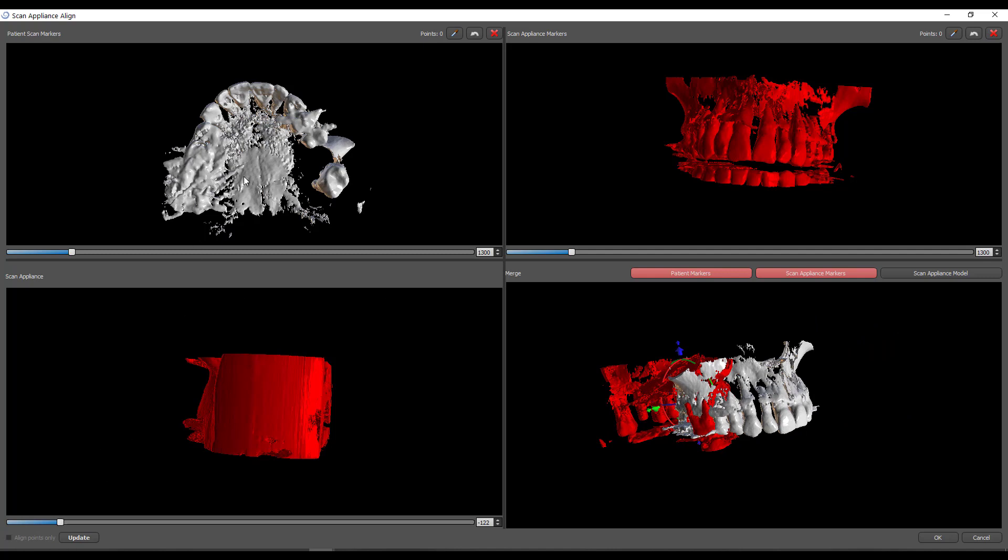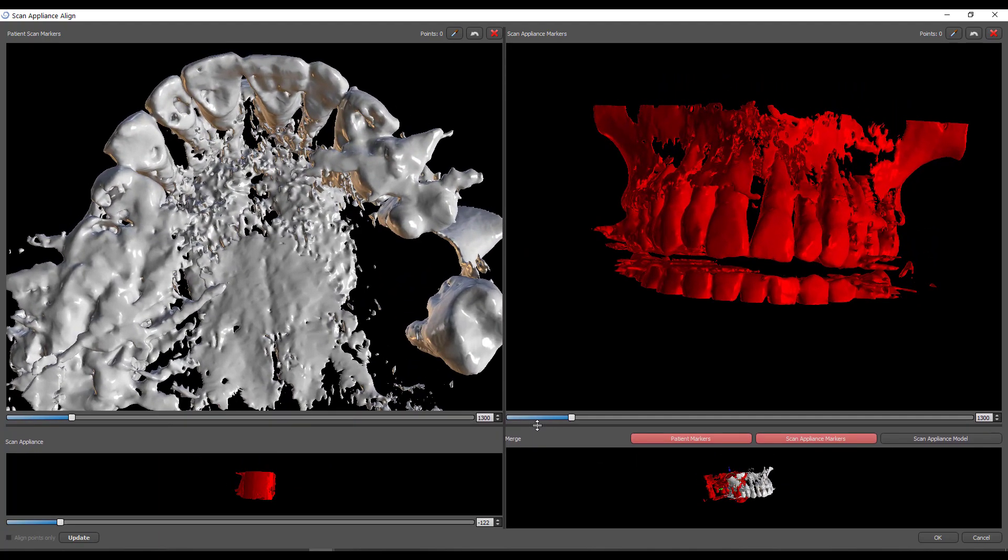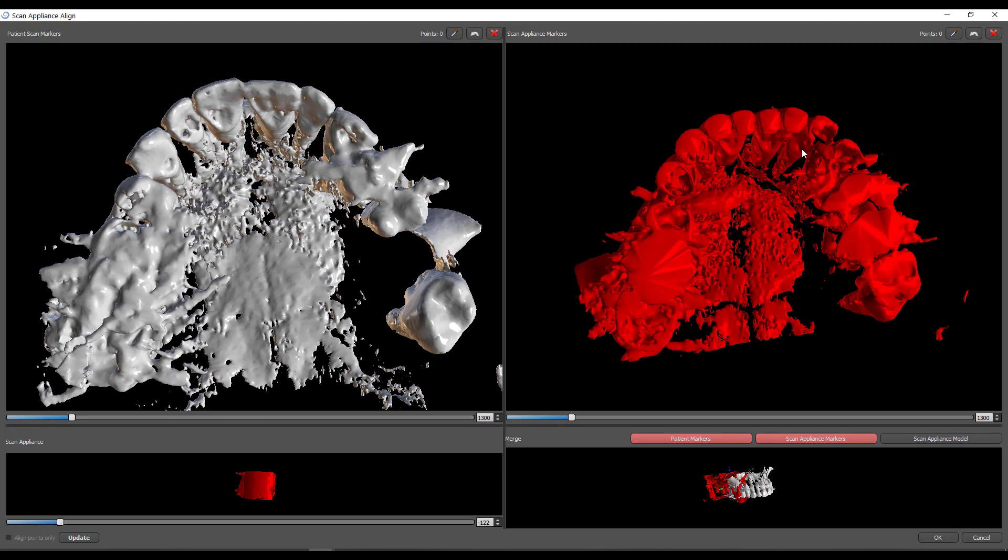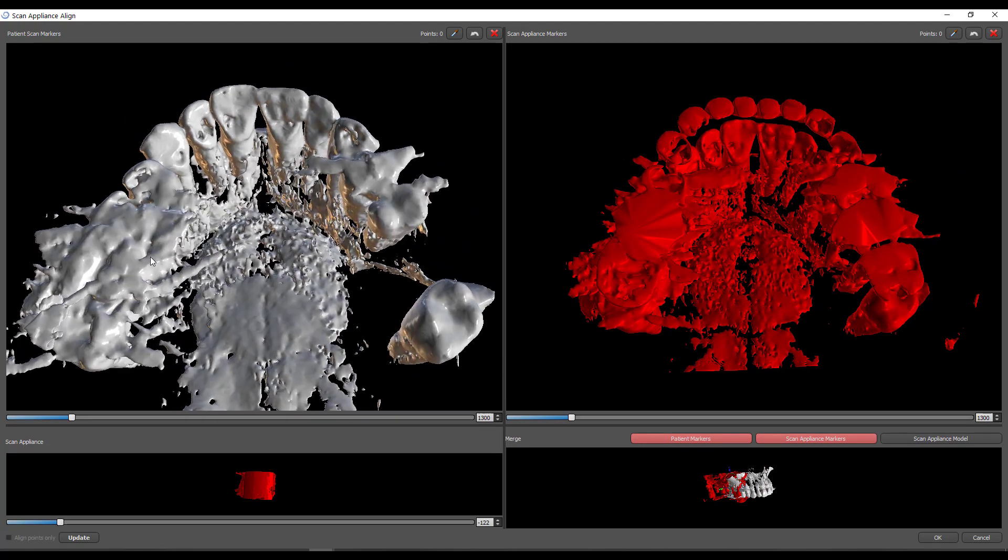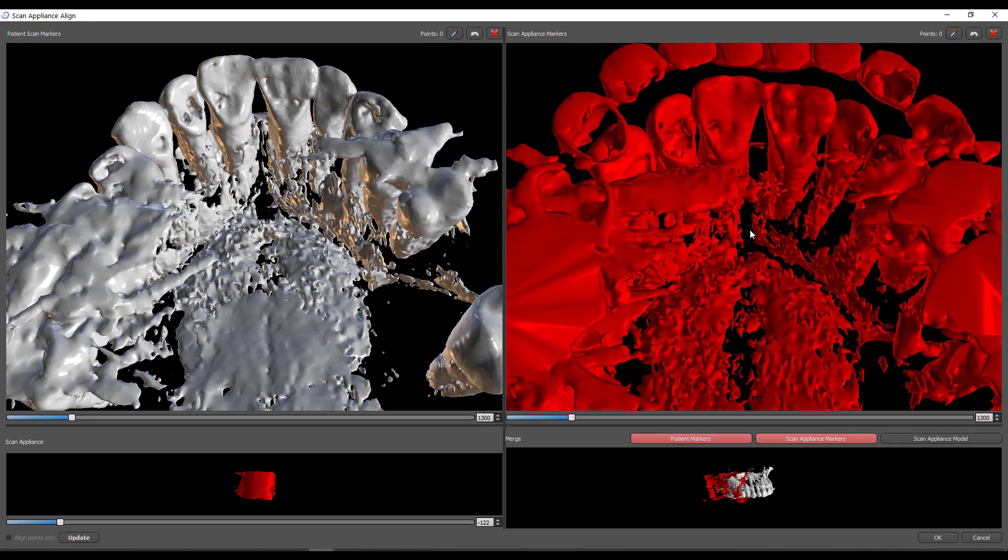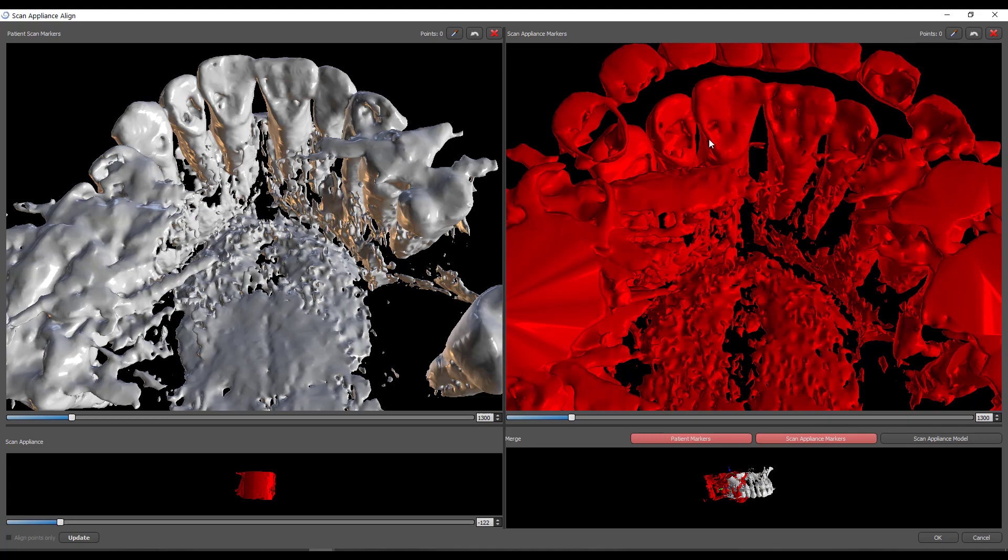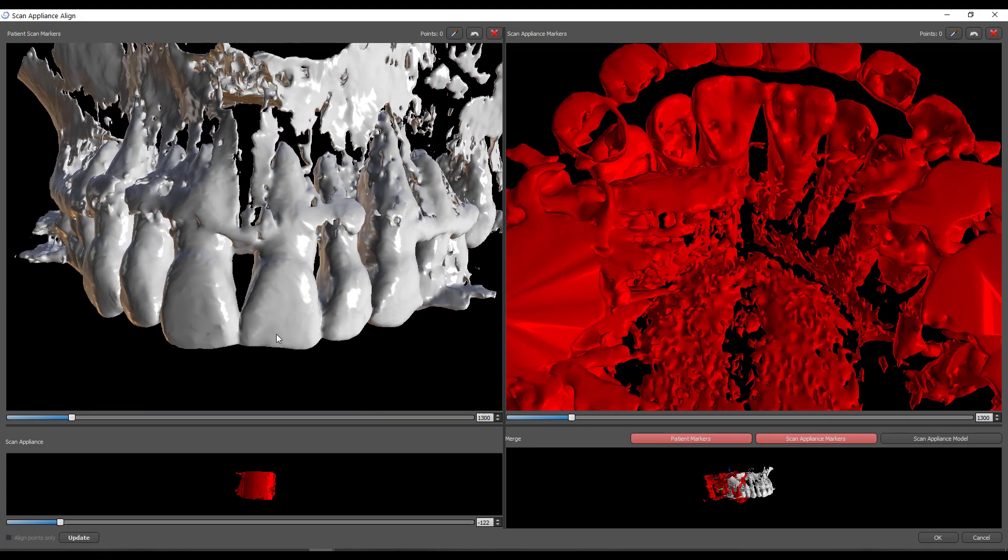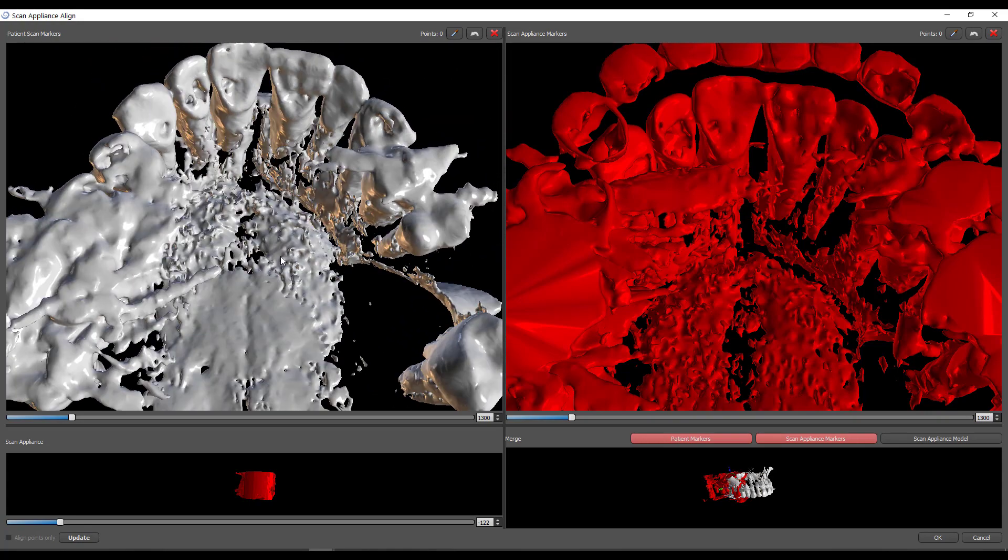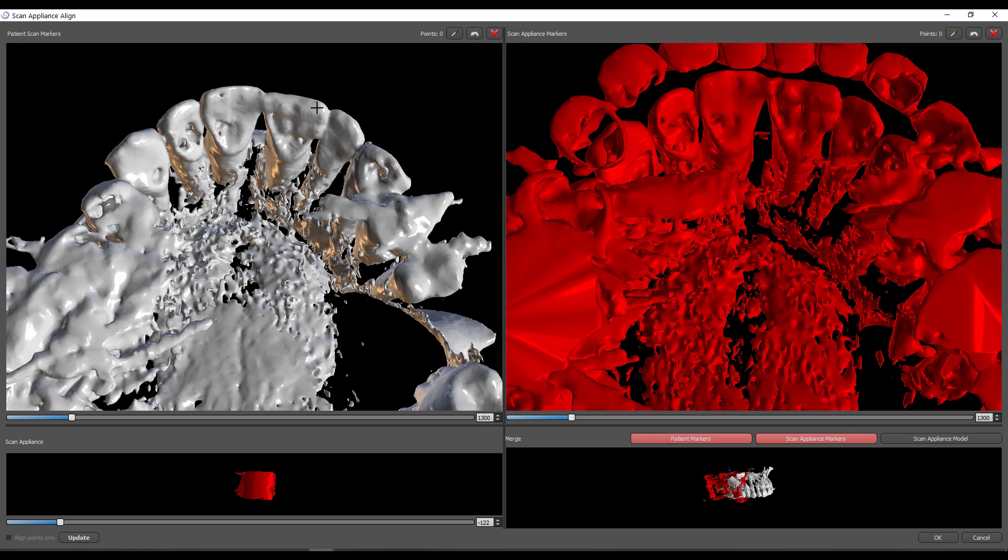And so what I'm going to do here is I'm going to actually go old school and stitch this by points. If you grab right here in the middle, you can maximize these more. And when I'm doing this, I'm trying to orient things in the same relative position and the same level of zoom, and that will assist you in picking the ideal stitching points. And it's also very important that you be as accurate as possible when doing this. I mean, you know, microns matter. So I'm looking for really distinct stitching points, things like incisal edges, things like cusp tips, notches on the teeth, things like that that are going to show up. You can't really use things like gum line because, you know, the gum line may or may not show up very well. On occasion, you'll see some good root anatomy that you might be able to use. But usually I'm looking for cusp tips and incisal edges.